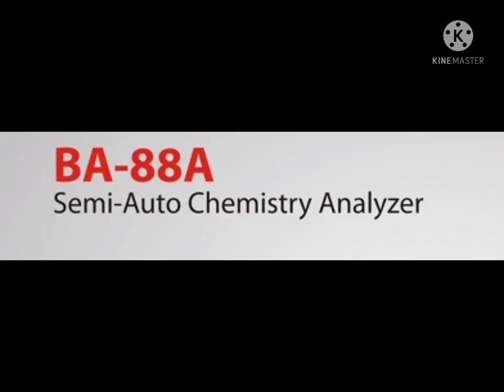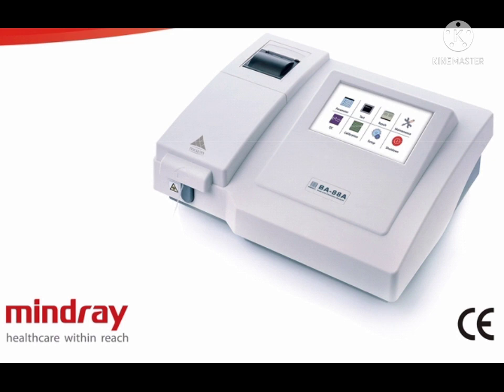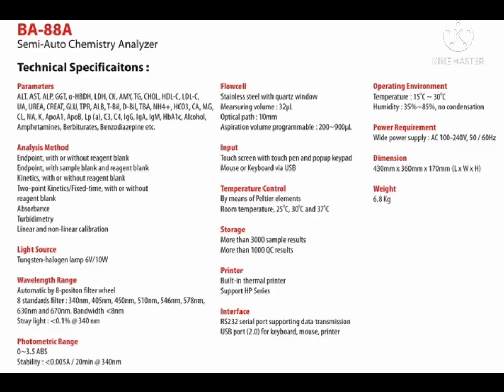The next one is a semi-automatic chemistry analyzer. Technical specification: many biochemistry parameters can be performed in the semi-automatic analyzer. Analysis method: endpoint kinetics, fixed time kinetic. It's common like other instruments. Turbidimetry, linear and non-linear calibration, all these methods can be performed. Light source: tungsten halogen lamp, 6 volt 10 watt.